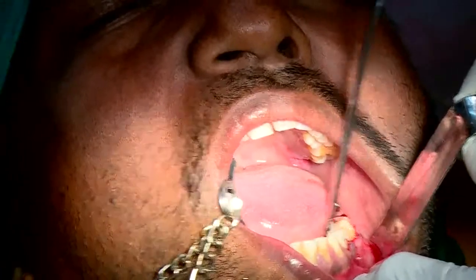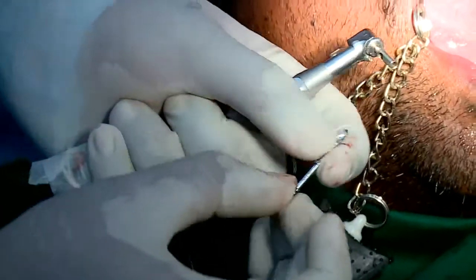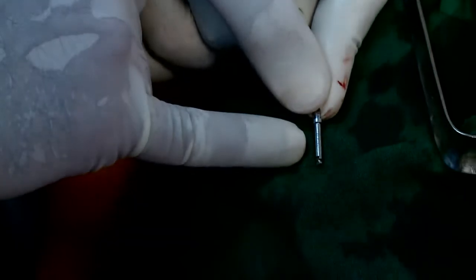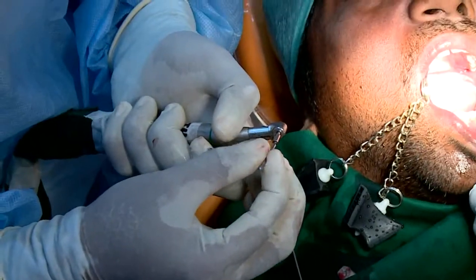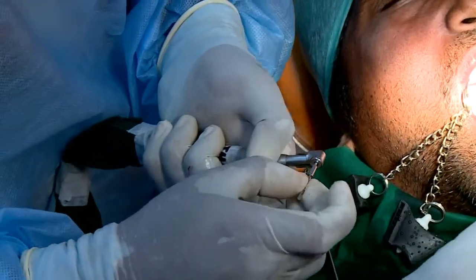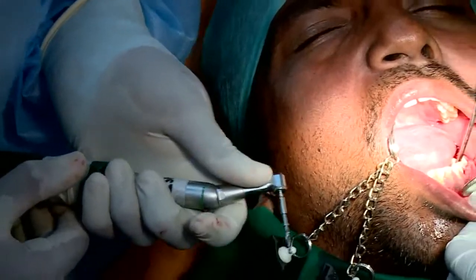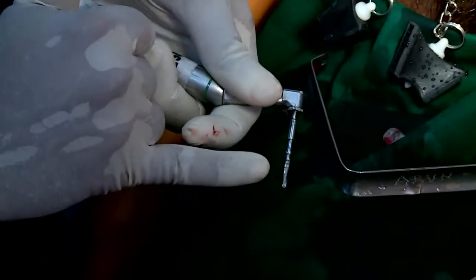So we have gone through the initial drill. I'm going to use the next drill. Usually all these drills will be marked, and here I'm not sure whether it can focus that much. Here it will probably say something like a 2.0 drill. There will be markings on all these drills. Now when this drill is running, can you focus the drill please?